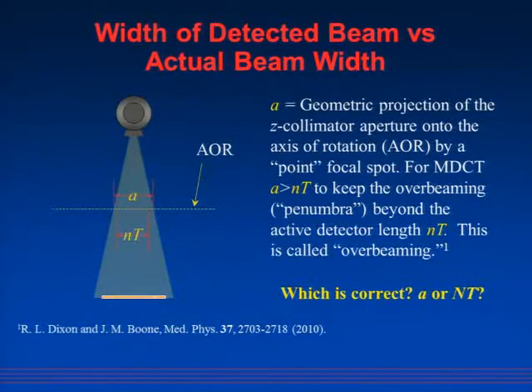No matter what you're doing, when you're whirling something around and you've got 28 G's of acceleration acting on all of the hardware in the gantry as it's rotating, you've got to have a little bit of slop in your system so that if there's a little bit of vibration of the beam relative to the detectors, you're not clipping the edge of the end detectors.